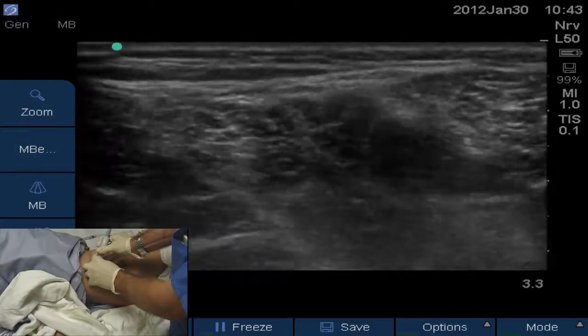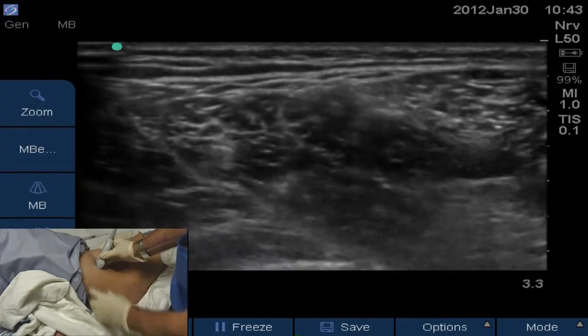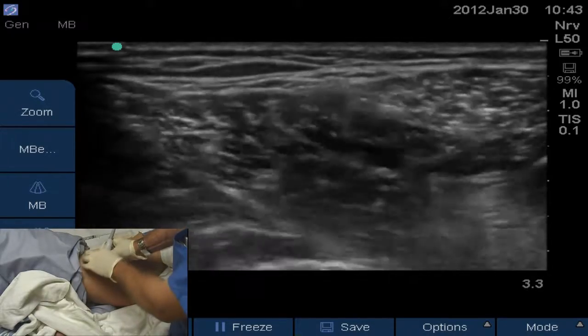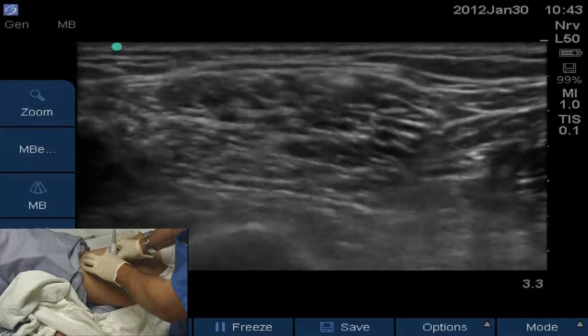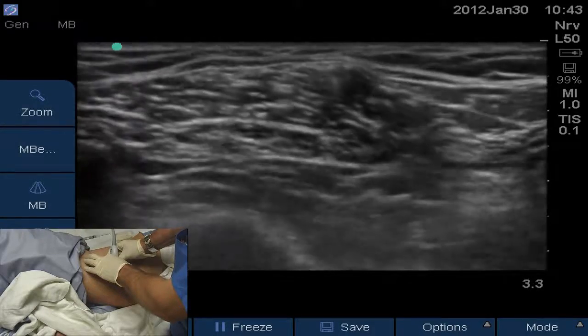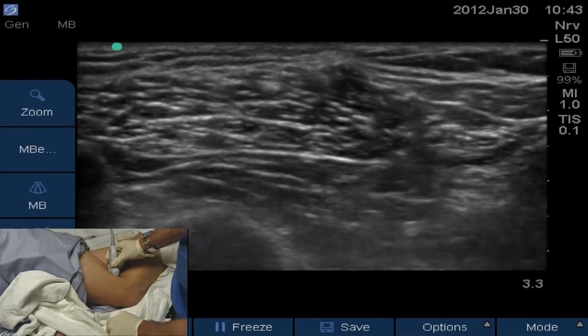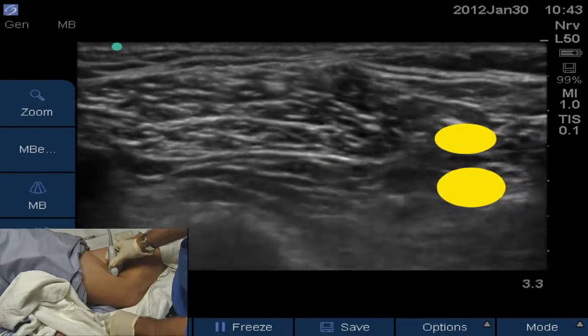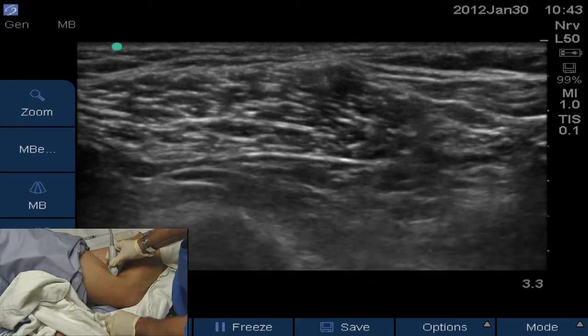And that's interesting. The peroneal nerve really joins almost at 12 o'clock relative to tibial, which makes it a little trickier. In fact, I think probably what we're going to need to do is block these as if we're doing two nerves right about there where they're totally separated from one another. Okay, and that's where we'll block it. We'll literally just do two nerve blocks. Inject around tibial and then inject around peroneal separately.